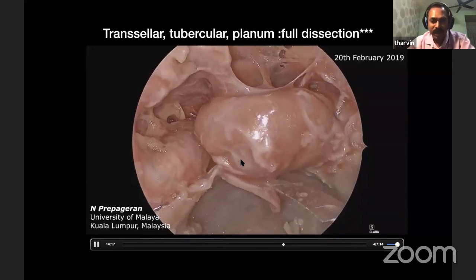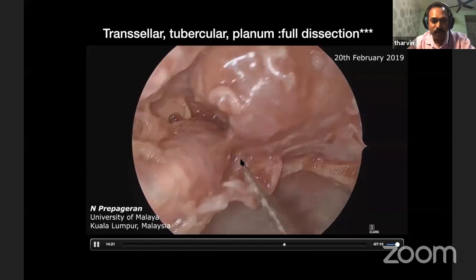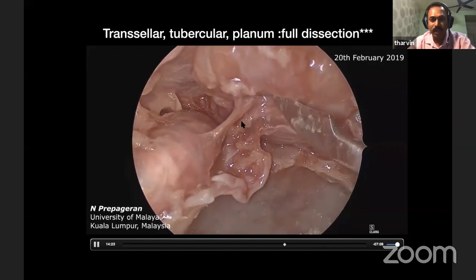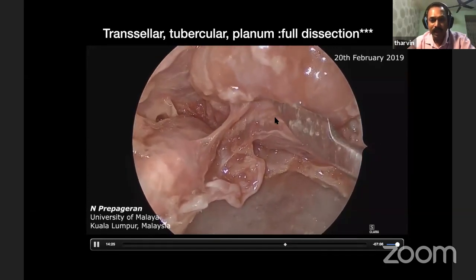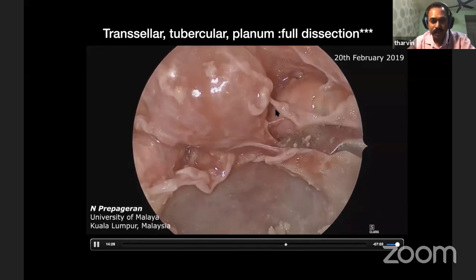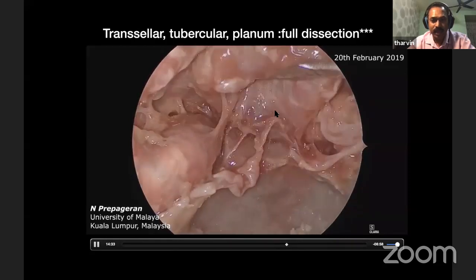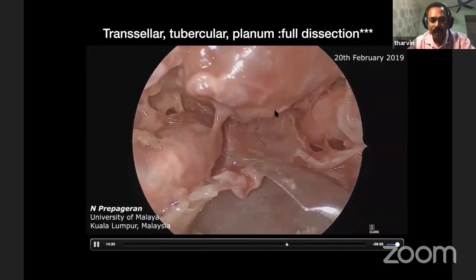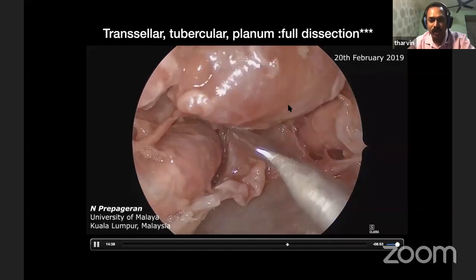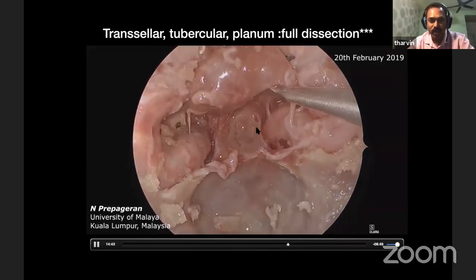And with this now, we dissect the ligaments, and as we dissect the ligaments, we can do a pituitary translocation. That's the inferior hypophyseal artery supplying the pituitary gland. And by cutting the ligaments all around the pituitary gland, we can actually translocate the pituitary gland superiorly, maintaining the blood supply with the superior hypophyseal artery, and that gives us now the posterior clinoid, as you can see.